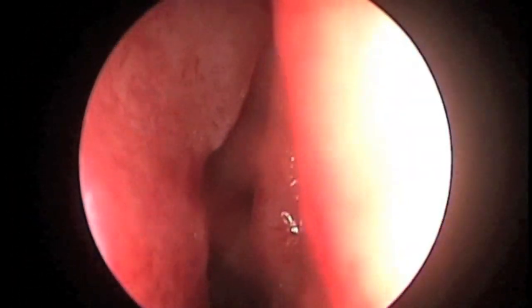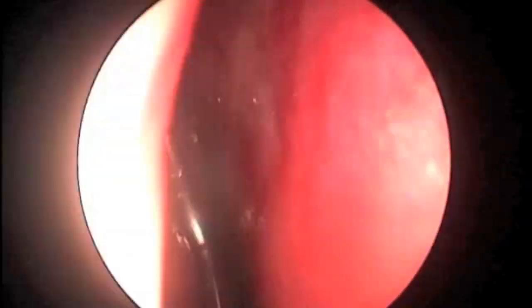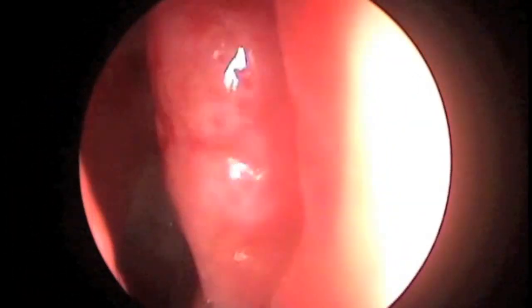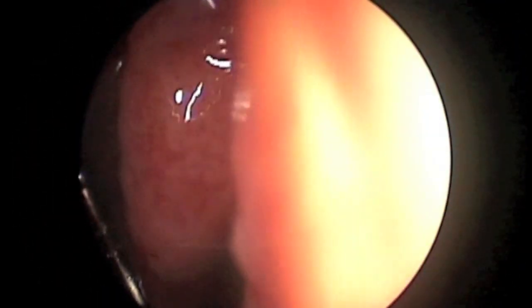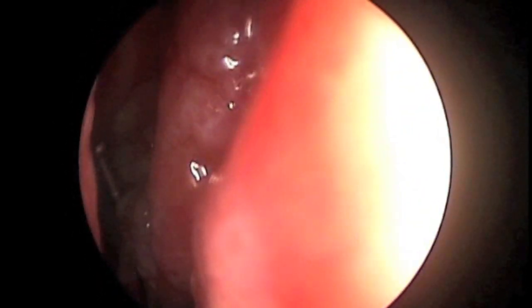The right side is shown here. We're infracturing the middle turbinate after he's been injected. The malleable tip has been bent to about 135 degrees at the one centimeter mark, so we have a J-hook. This is then used as an ostium seeker like you would normally do during endoscopic sinus surgery.